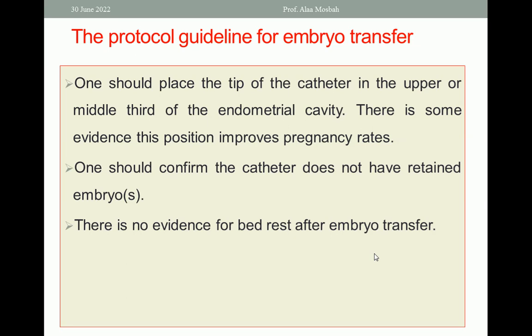One should confirm that the catheter has not retained the embryo by looking under the microscope after doing the embryo transfer and extraction of the catheter. Please look immediately under the microscope to be sure that there is no retained embryo inside the catheter.